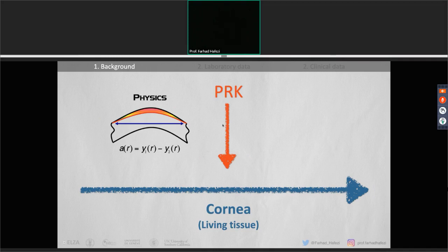And this is why the flying spot lasers have to jump across the cornea in order to avoid heating. But that was about it. So before the intervention, we think mathematically and physically. 4 weeks after the intervention, the patient comes back to you with a quite massive haze.